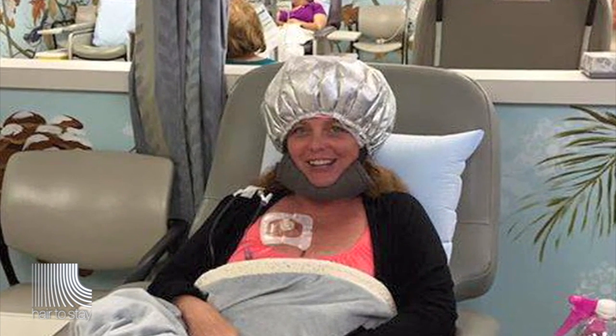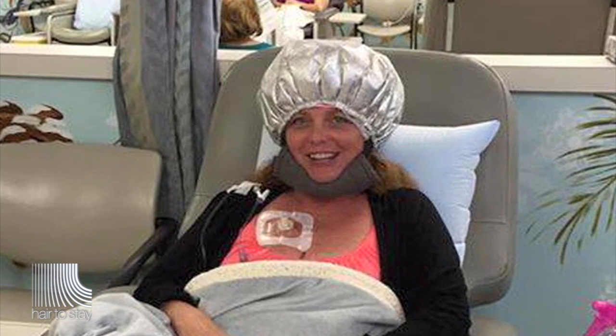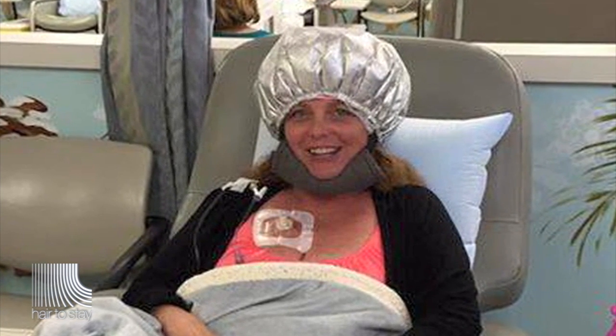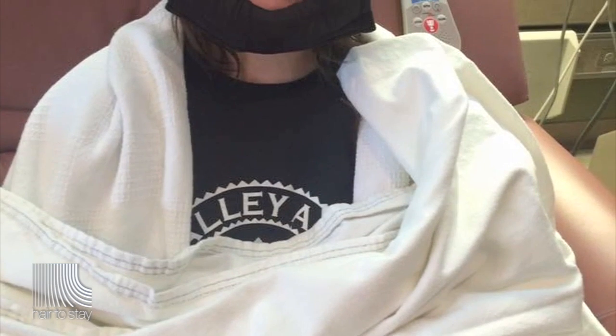There are different types of ways that you can cool the scalp. One way uses a material that is insulated, can be frozen, and is flat and soft. You freeze it to be very cold, then shape it to the head and put an insulating cap on top of it. That starts the cooling period over 20 to 30 minutes, after which the cap warms up and you change it.